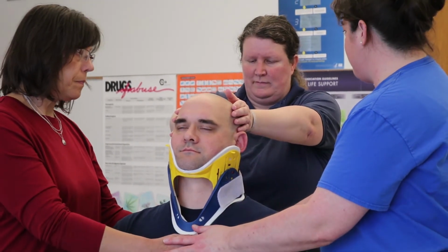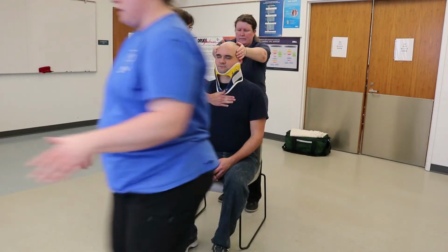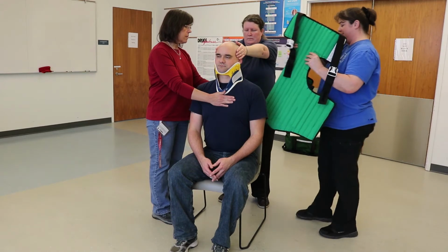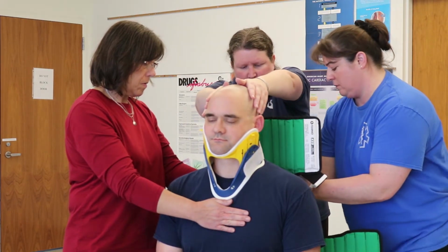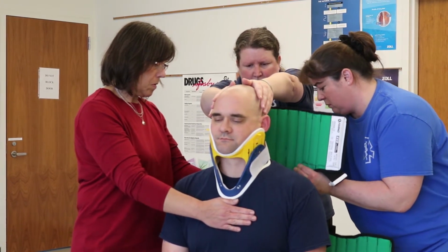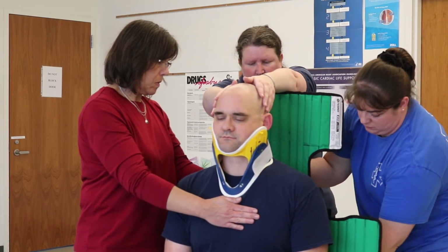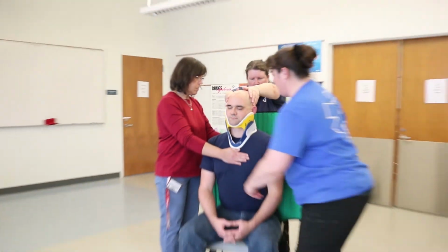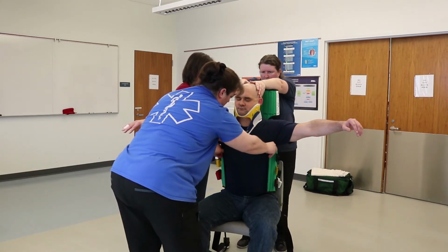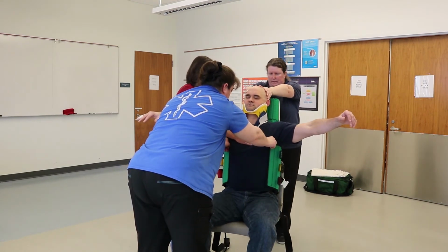Move the patient forward on the head's count of 3. 1, 2, 3. And please hold. Okay, if you could please put your arms up. And on head's count, we will move the patient back. 1, 2, 3. Okay.